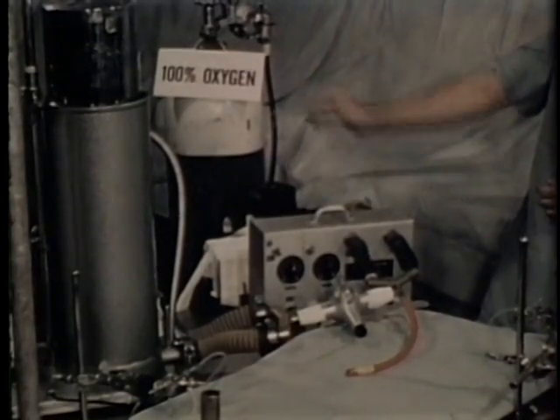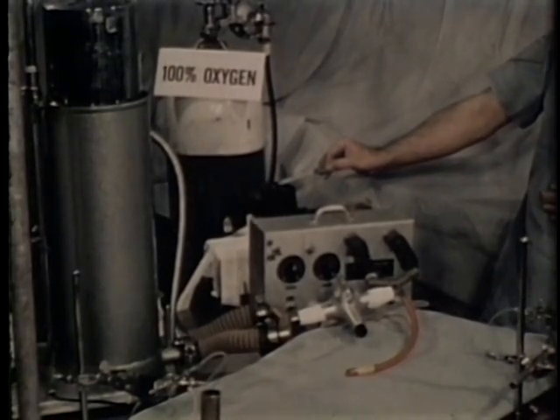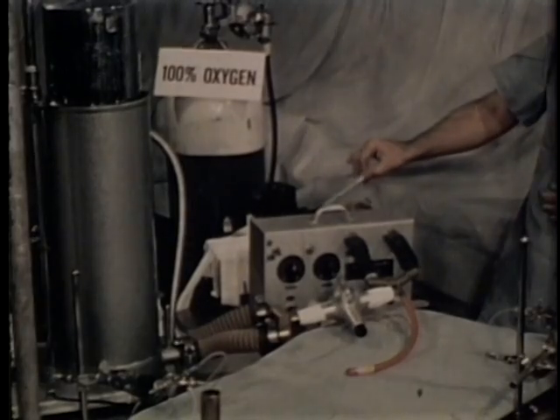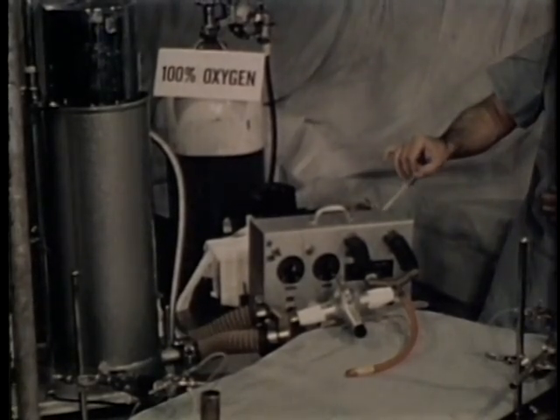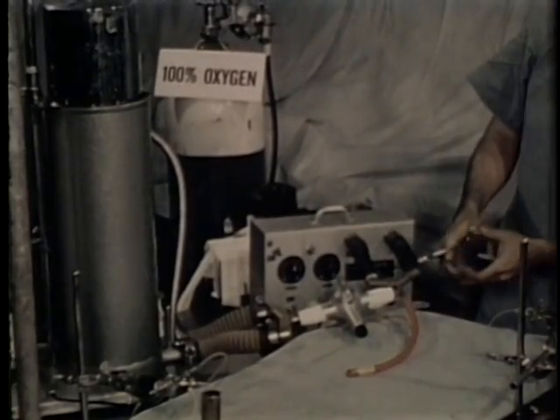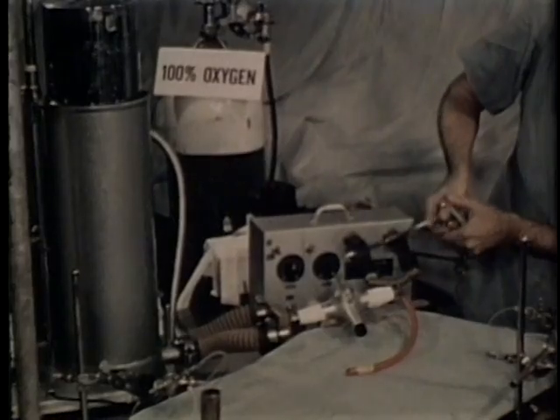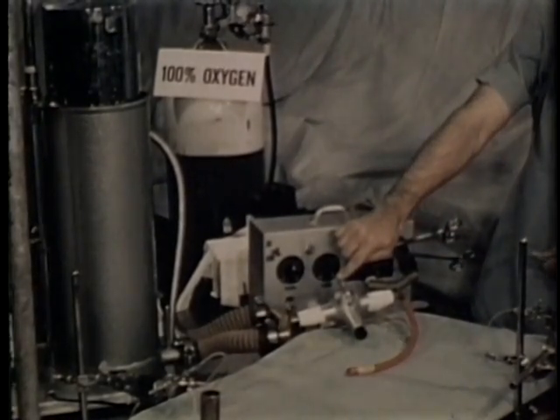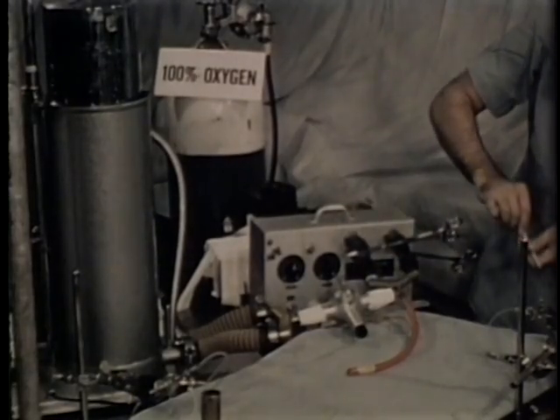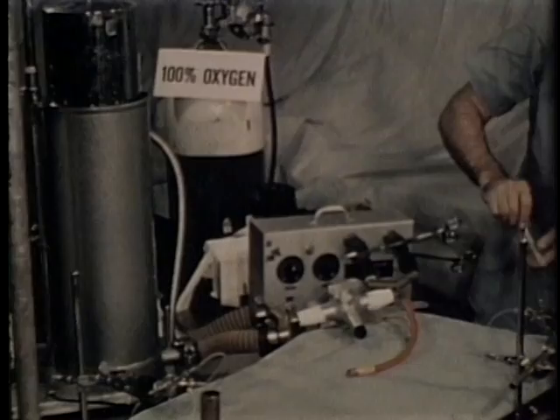Attention will now be given to the ventilatory circuit. The oxygen flows from the tank through the adjustable pressure limiting valve to the ventilator. During apnea, the ventilator is stopped, the breathing tubes are clamped, and the three-way stopcock is turned so that the circuit bypasses the ventilator. The spirometer becomes the source of oxygen.